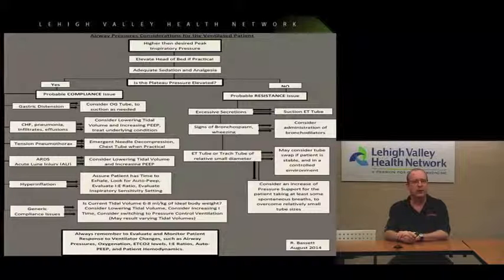It'll help lower their airway pressures. It also helps with drainage and secretions, and might help reduce the risk of ventilator-acquired pneumonia also. I think the patient will just tolerate it better. If you could just imagine a 350-pound patient being mechanically ventilated, being completely supine in the bed or on a stretcher, all that pressure that's up against the diaphragm, of course it's going to increase our airway pressures.